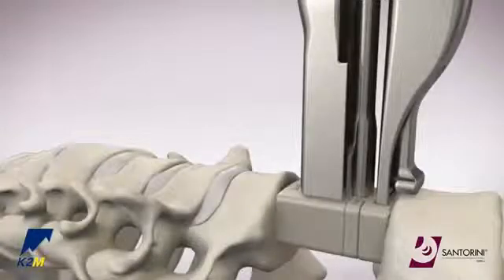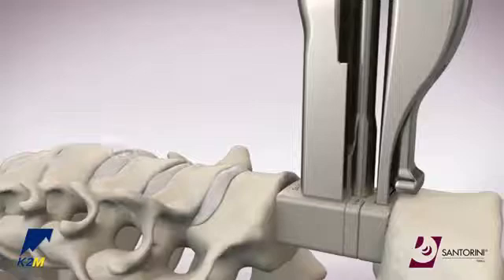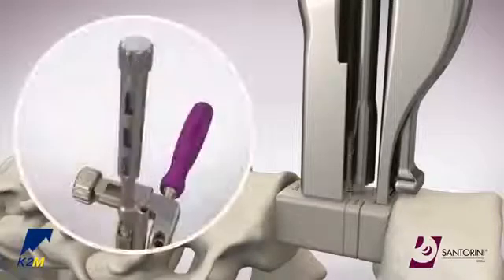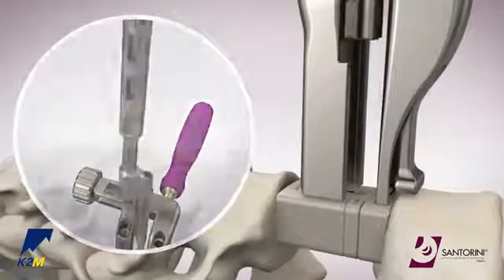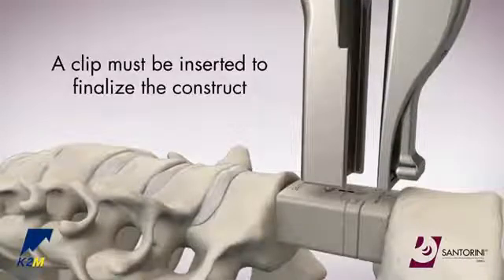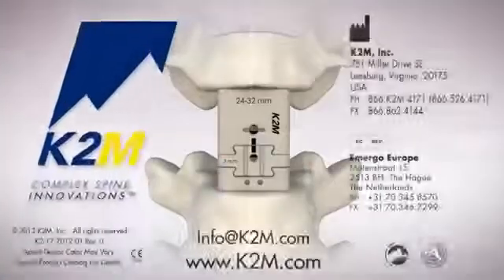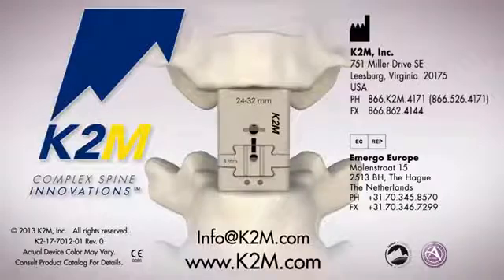When the final clip has been inserted, remove the inner shaft of the clip inserter to disengage it from the clip. Turn the proximal knob of the clip inserter counterclockwise to remove it from the site. Then use the size 15 driver to disengage the distractor from the cage. The Santorini Small Corpectomy Cage System from K2M, Complex Spine Innovations.